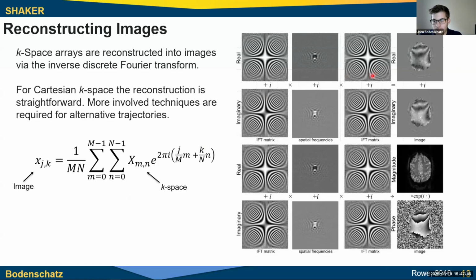If you do a more interesting trajectory of K-space, like the radial one, at that point you'll usually have to have some sort of algorithm, regridding, approximation, something of that nature to either get it in a Cartesian grid or do some sort of approximation to get an image. There's been a lot of work done on that. One of my later projects will actually be involved with that as well. But it's just an extra set of steps you'll have to take to reconstruct an image.